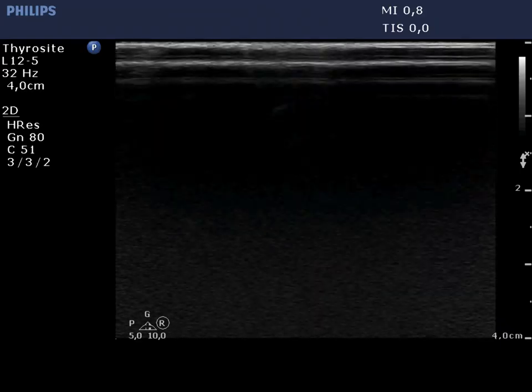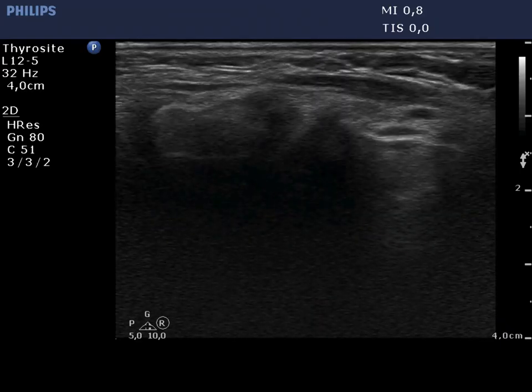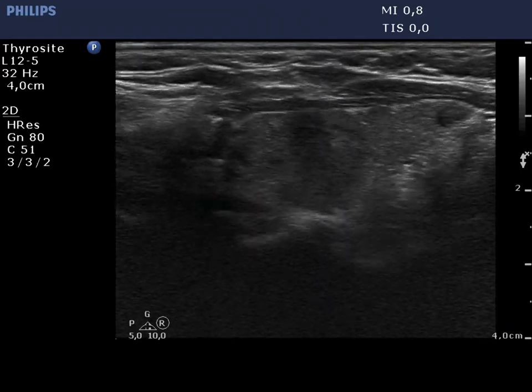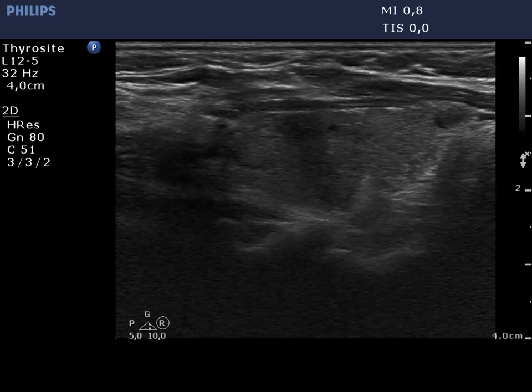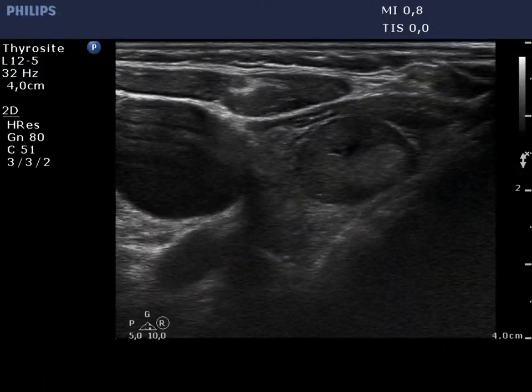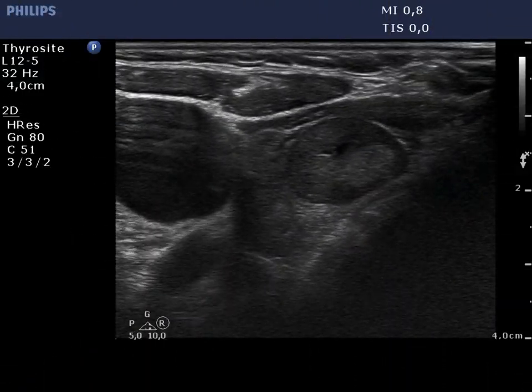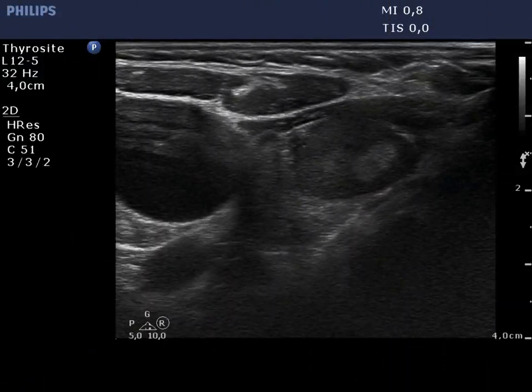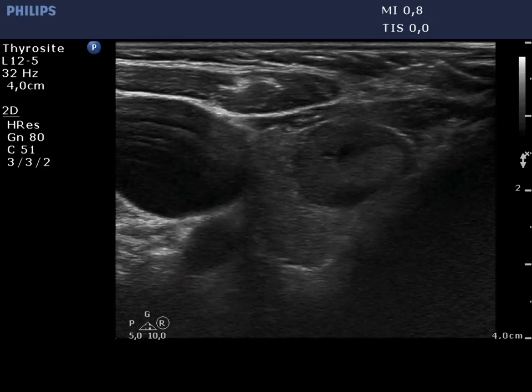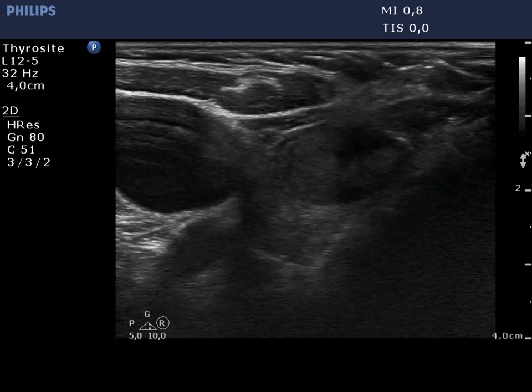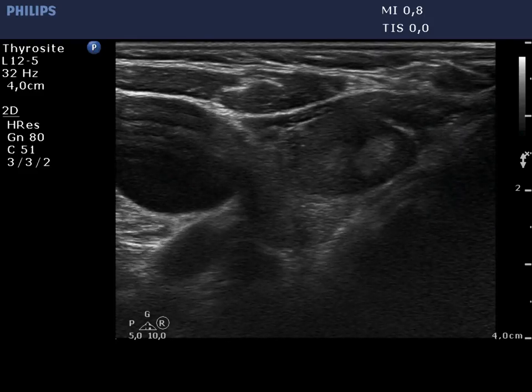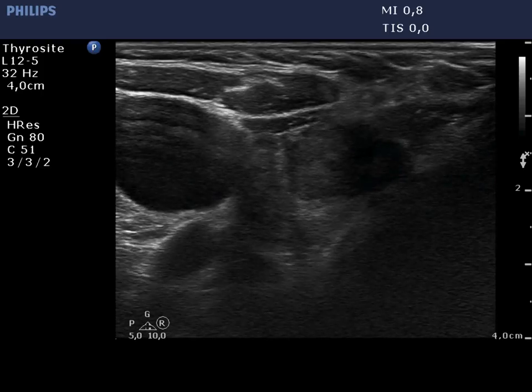The left lobe is moderately hypoechoic and has discrete areas which do not fit pathological nodules. The lesion in the right lobe is demonstrated again. This is probably a nodule in the pathological sense.